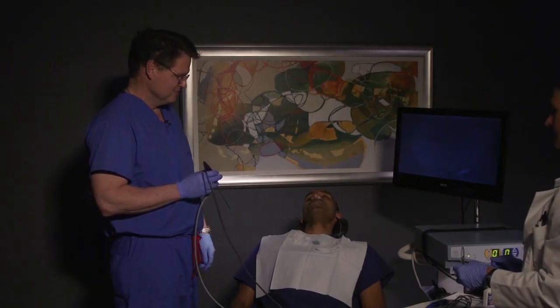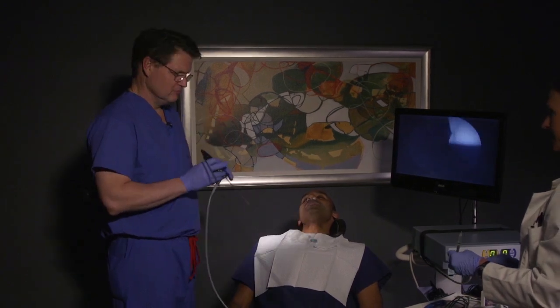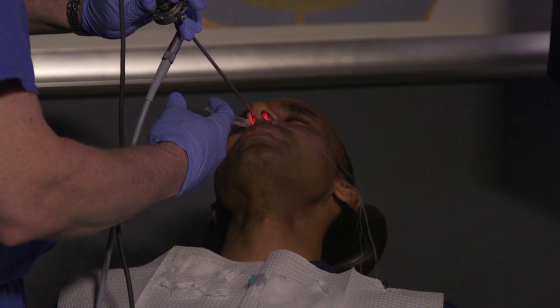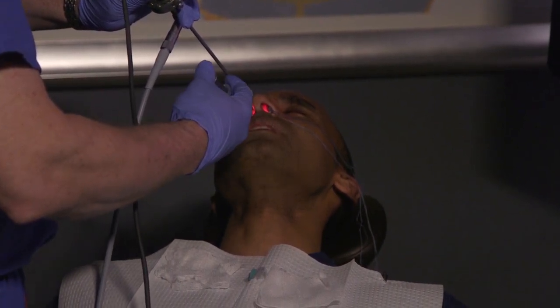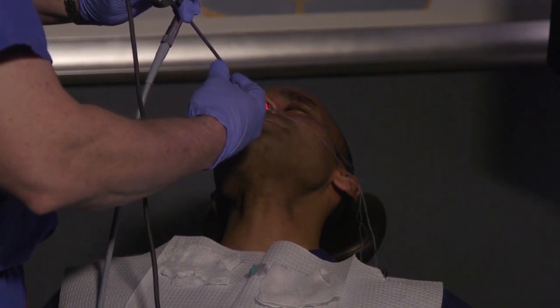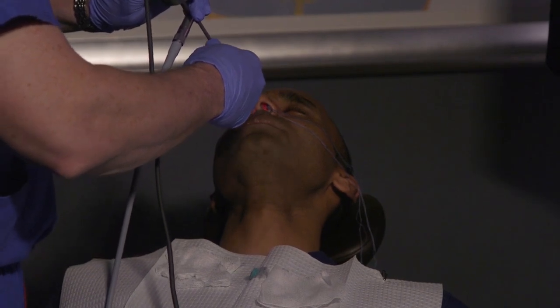It's been about 20 minutes with these sitting in my nose, and now we're going to go ahead and get started. Dr. Rossiter is going to man the ship here. Sensation-wise, not a whole lot of anything going on, which is good. A little clickiness with either the camera or the numbing injection, but pretty low key generally speaking.